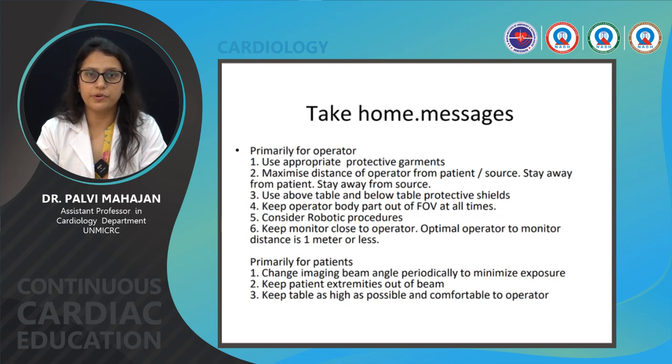Maximize the distance of the operator from the patient, stay away from the patient, stay away from the source. Use above table and below table protective shields. Keep the operator body out of field of view at all times. Consider robotic procedures. Keep the monitor close to the operator. Optimal operator to monitor distance should be 1 meter or less.